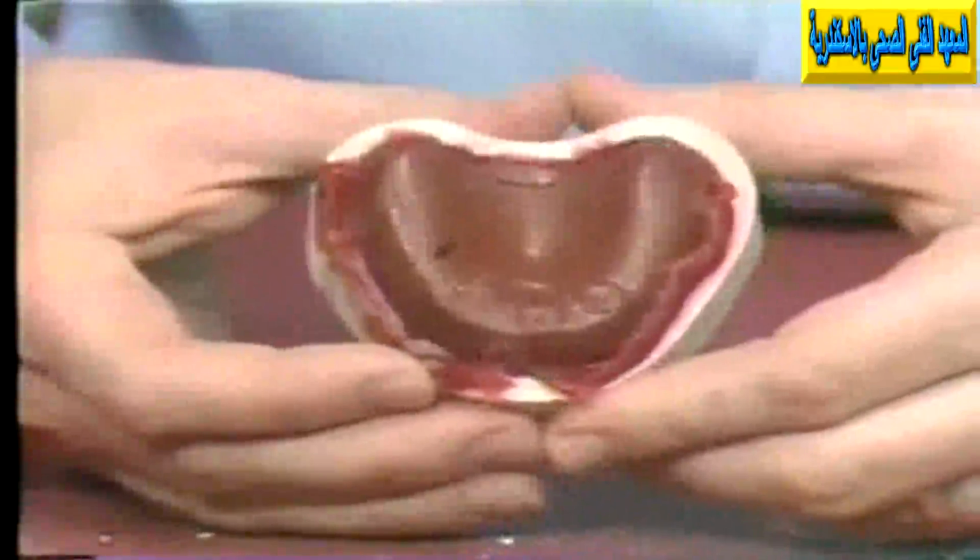Remember this, particularly using the acrylic resin materials. It's very easy to break the master cast, and if any chipping or breaking of the master cast takes place, then we have to go back and take a new final impression. The master cast cannot be altered in any way.